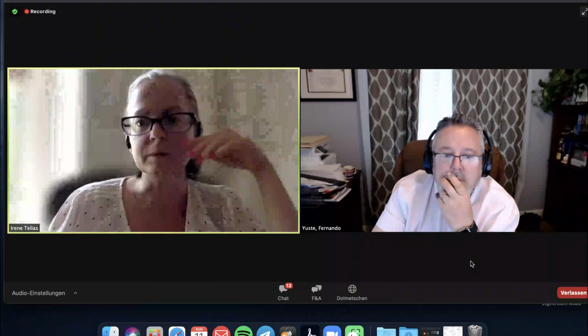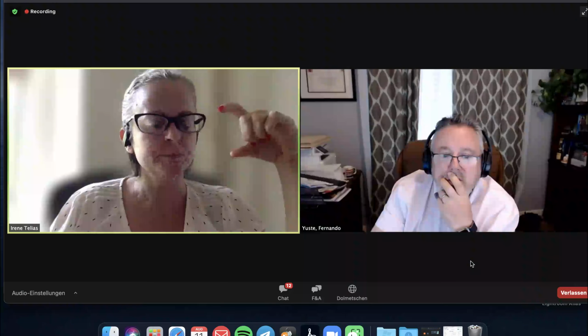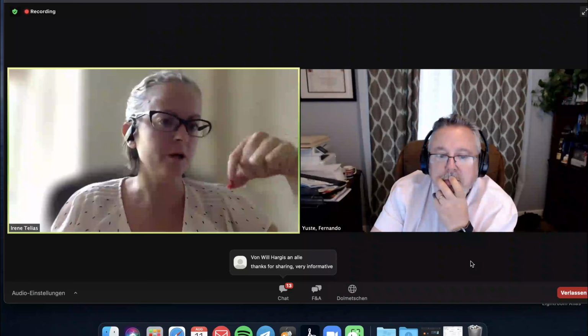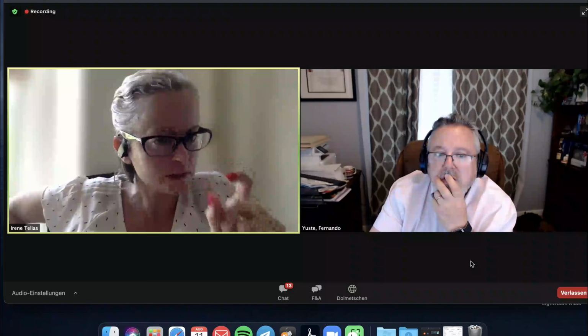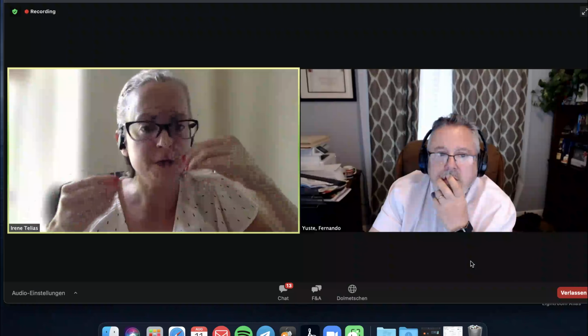One of the caveats about P0.1 is that when you have intrinsic PEEP, the drop in airway pressure does not start at the same time as the drop in pleural pressure. It starts a little bit later. And because P0.1 is so sensitive to the initial drop in airway pressure, this might generate some error in the measurement.